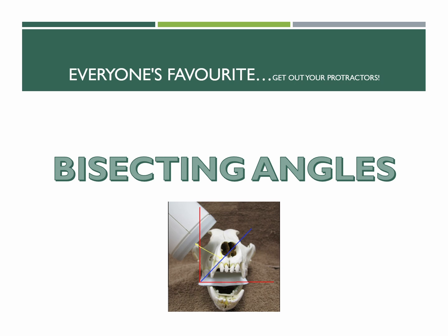The tooth is laying flat on the jaw, and we're showing the angle of our tooth. We're showing the angle of our film, which in this case is a 90. The bisecting angle where we put our tube head is halfway between, about a 45-degree angle. And that's where we're going to take it. And trust me, as long as you're coming directly on the tooth, you're going to get a good x-ray.